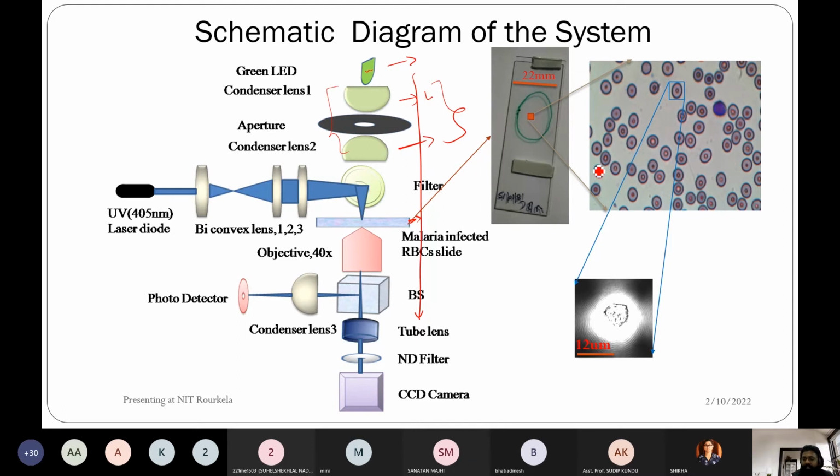A thin layer was prepared on the slide, and you can see how the cells are clearly separated. Then the micro objective collects the light information carrying the cells, and then there is a beam splitter, which is used to divide your light beam into two parts. Suppose this beam splitter is 50 to 50, then your light is divided into two parts, suppose here it is 1 milliwatt.